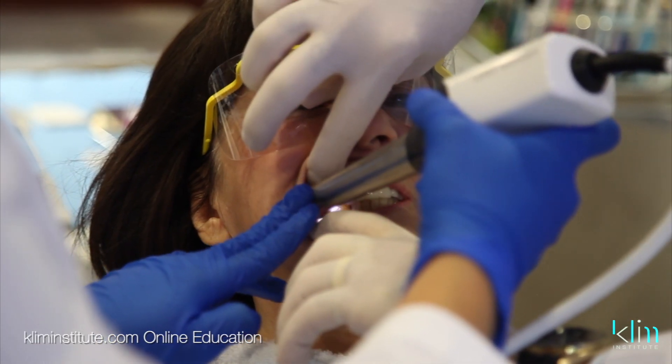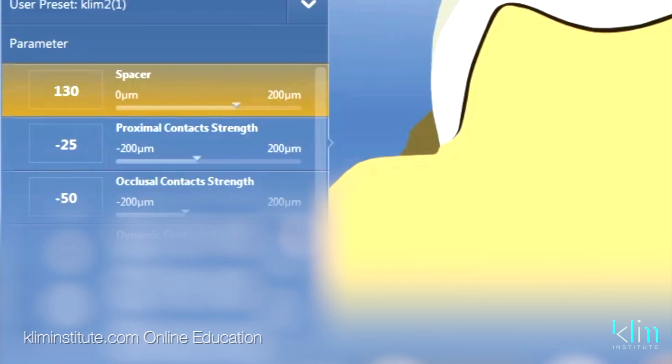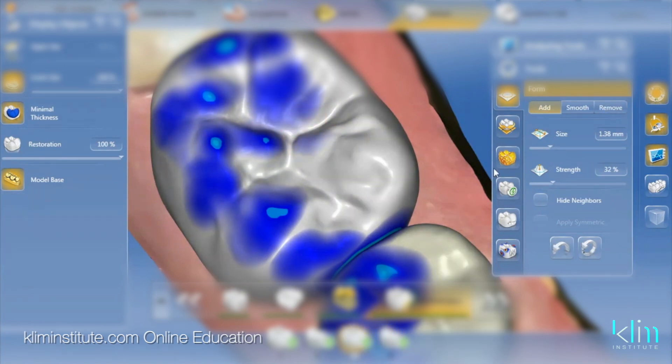So the way I nail my occlusion: make sure my reduction is enough. When I take my buccal scan, the patient is sitting up — I have them bite firmly, but before that I have them seat the PDLs. I make sure I understand my parameters: there are two major ones for occlusion. Occlusal offset, which is now in the manufacturer screen, and occlusal contact strength set up in your parameters. When you design your occlusal contacts, you want to see them. The contacts I set up on my screen are what I see with my articulating paper.